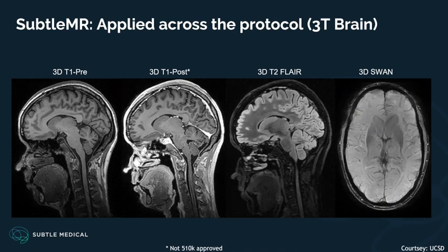Obviously, the post contrast images are not FDA approved right now. But the significant improvement in the image quality, which you can get consistently across the protocol, is a big benefit, as we have talked to various stakeholders in the institution.